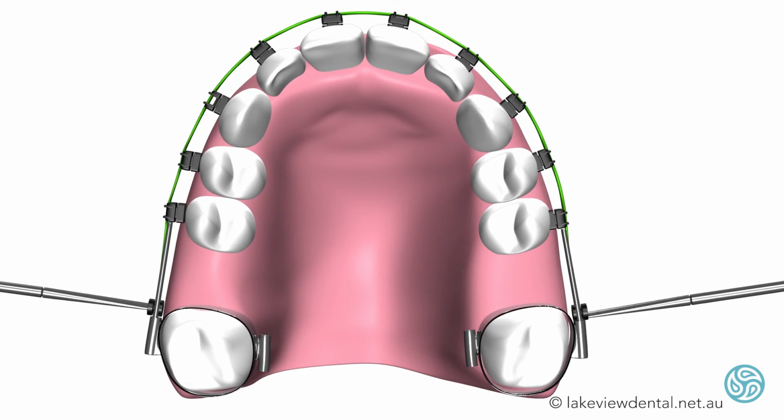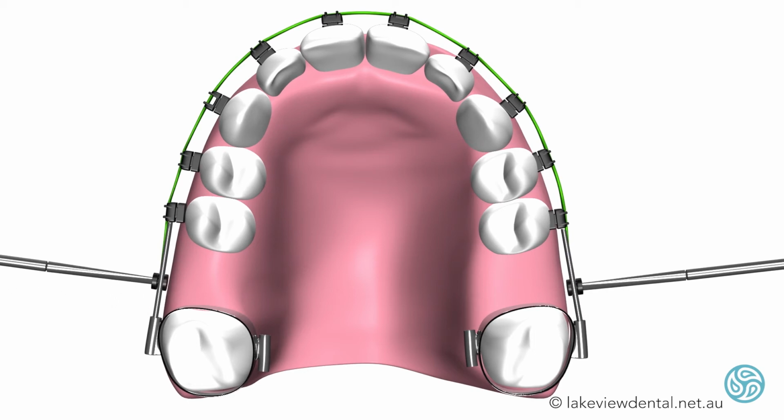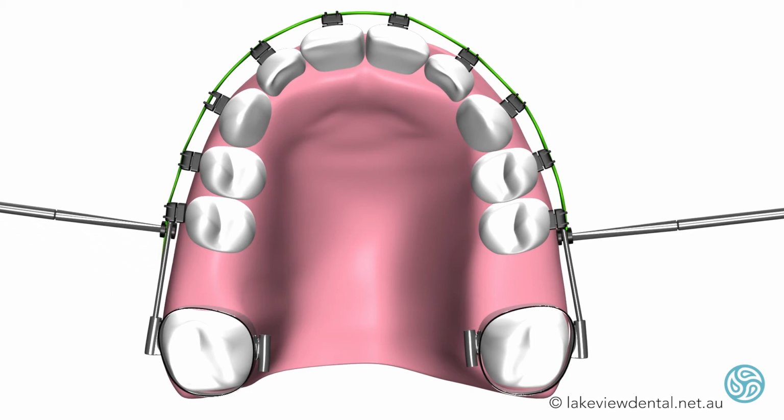As forward movement on the teeth is achieved, there is also an outward movement as the light wire would like to have a wider shape. This results in a wider dental arch. When the premolar teeth are pulled into their forward position, the stop locks are placed just behind these premolar teeth.